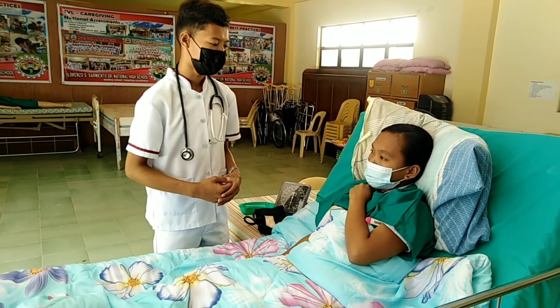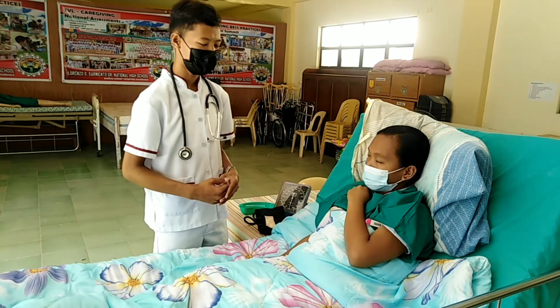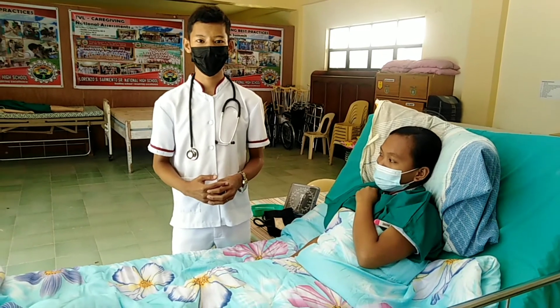So ma'am, your pulse is 55 beats per minute and your respiration is 20 breaths per minute. Record the pulse rate and respiratory rate on the client's chart and perform hand hygiene.